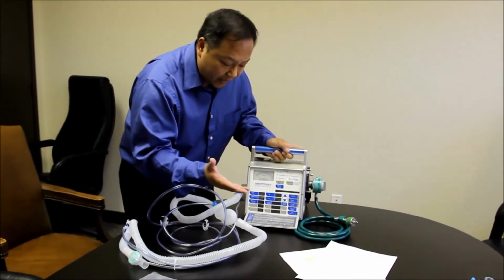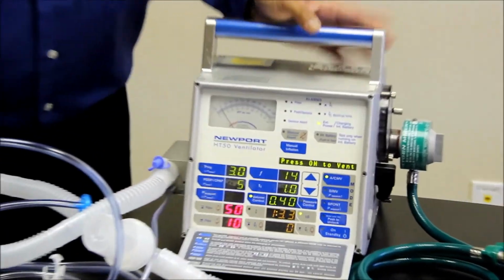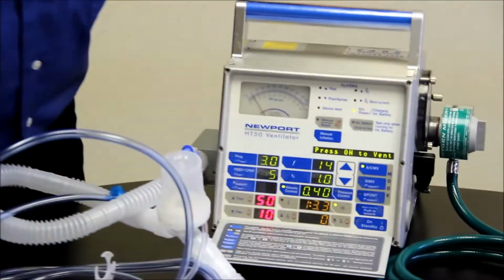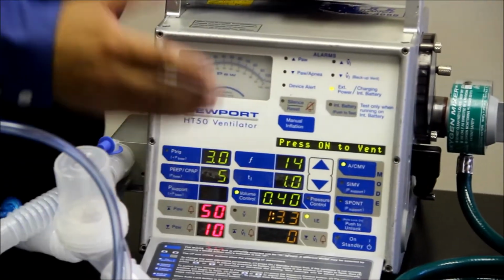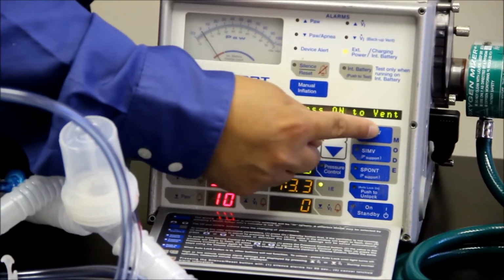Okay, so for that, I'm going to go ahead and turn the machine on, and I'm going to have to hook it up to this test lung so that it doesn't alarm too much. Okay, and so when they say AC, it's on AC mode right now. The green indicates that it's on AC mode.